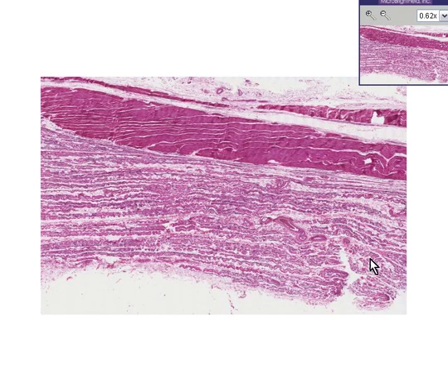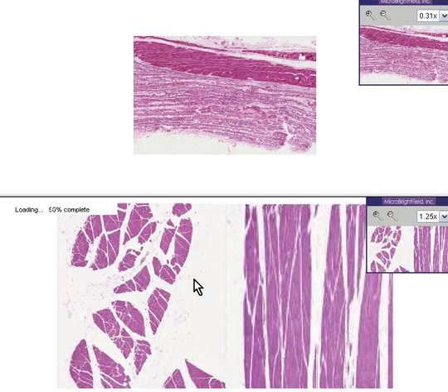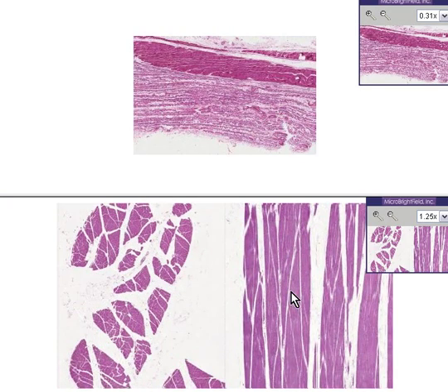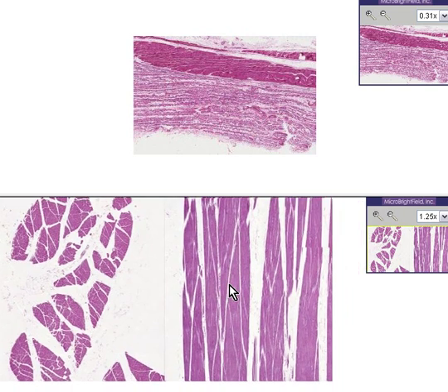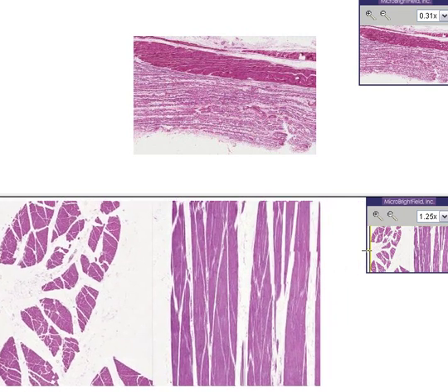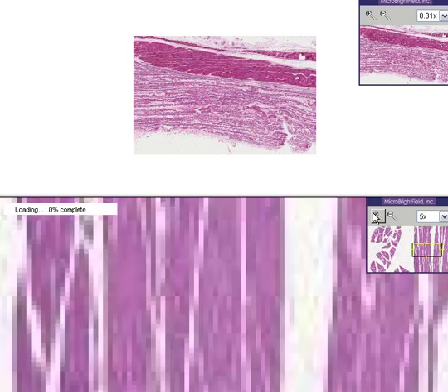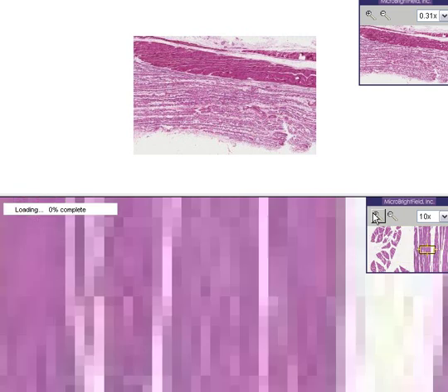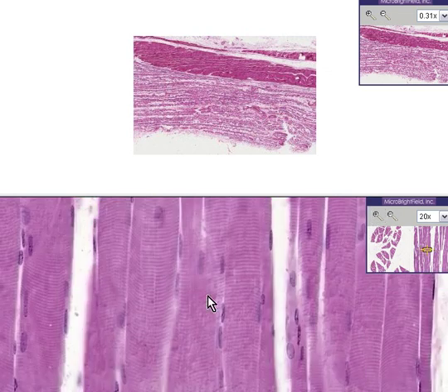Here is the disease in question to be discussed today regarding skeletal muscle, and on the bottom is absolutely normal skeletal muscle. Let's look at it and look at all the salient features.